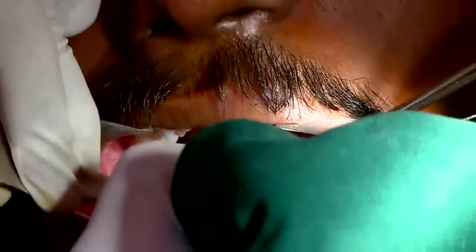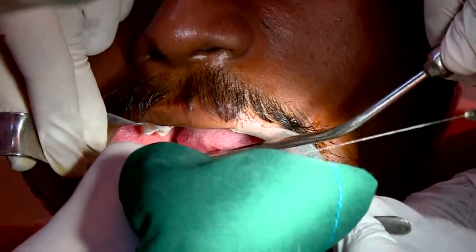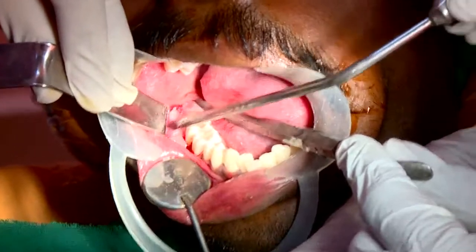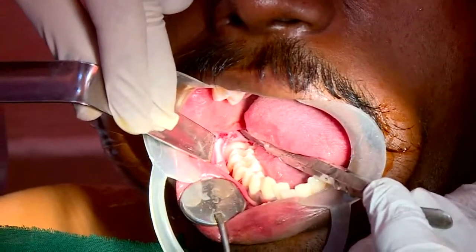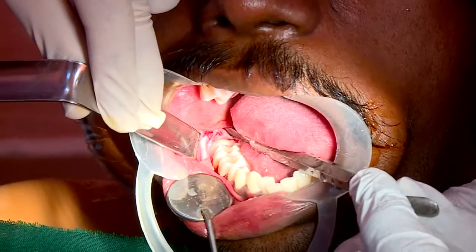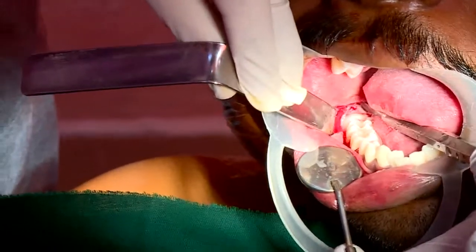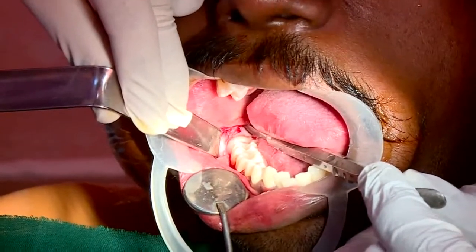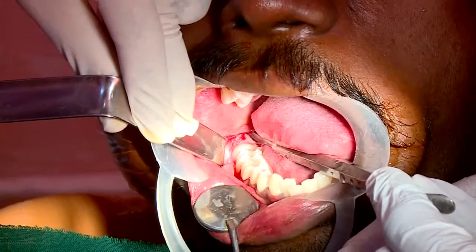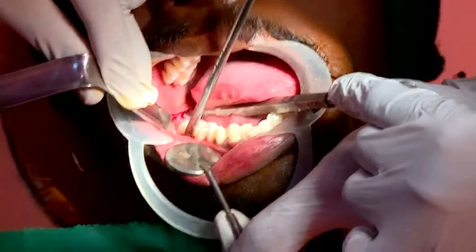The amount of bone to be removed: sometimes we will remove bone up to the cementoenamel junction. Or if you are sectioning a tooth, you may have to remove bone up to where you see the perforation of the tooth. Also, there is a distal spur of bone that has to be removed.